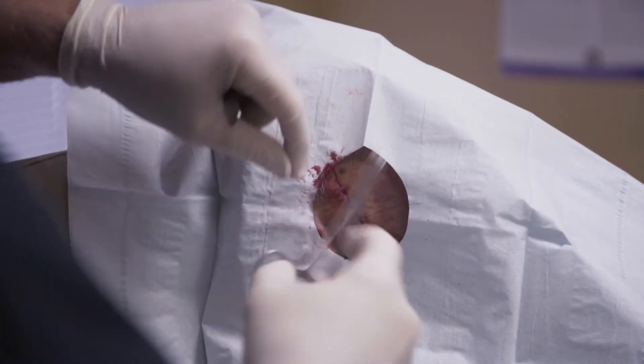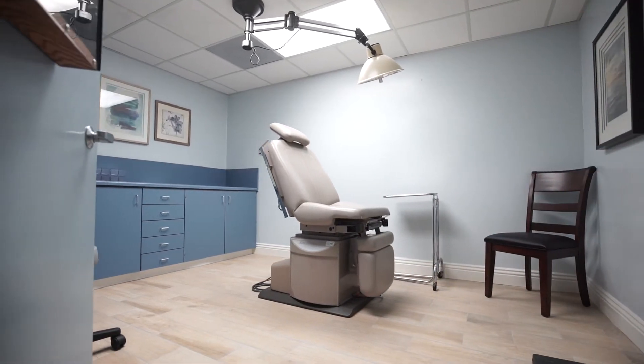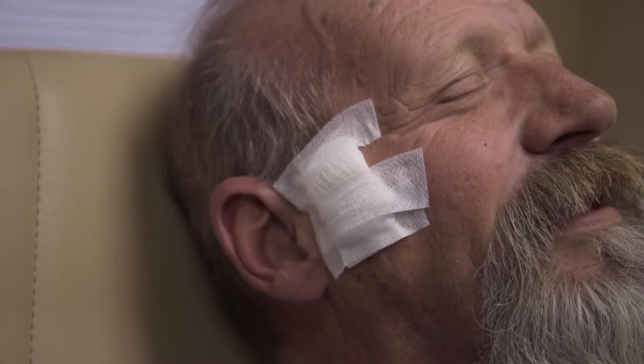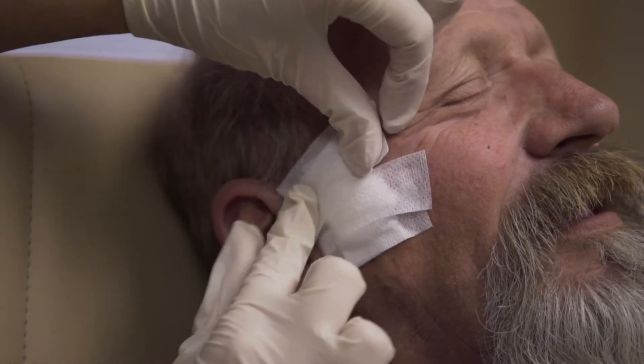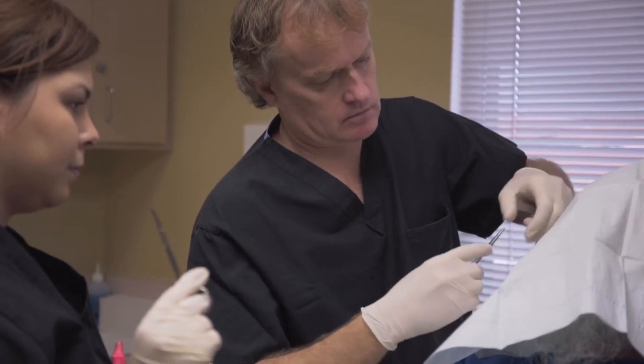Most of these procedures can be accomplished in the room themselves. Occasionally the area will be too large and may require a trip to an operating room at a later date. Once your closure is addressed, you will be bandaged and sent home with written instructions on how to care for the wound. In most cases you are able to shower and get the wound wet two days later, then dress it with a light dressing and some ointment. Your suture removal will be anywhere between seven and fourteen days depending on the wound itself, the location, and the size of the excision.